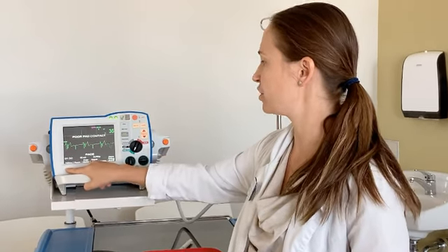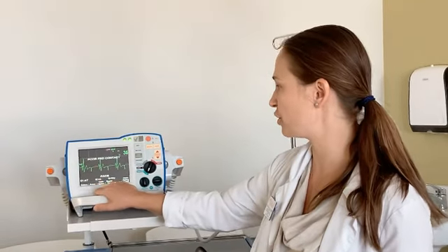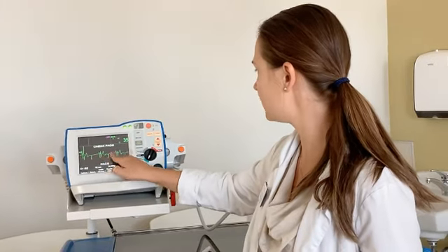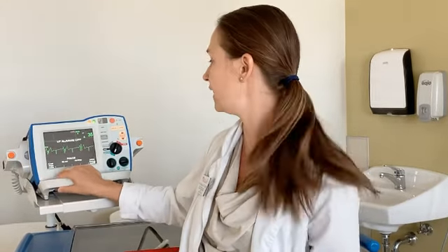What electrical capture means is that after an electrical discharge is delivered by the defibrillator, there is an electrical signal in the myocardium as well. What you're going to see on your EKG is an electrical discharge like this, and then a QRS complex that follows it, which tells me that after an electrical signal by my defibrillator, we also have an electrical signal in the heart.